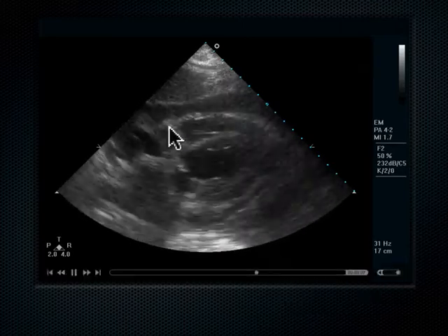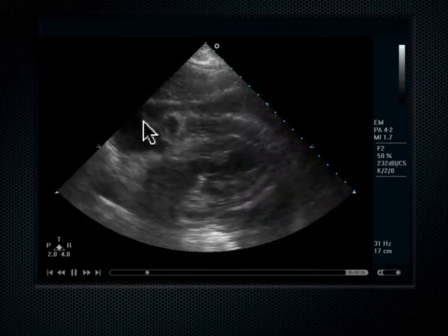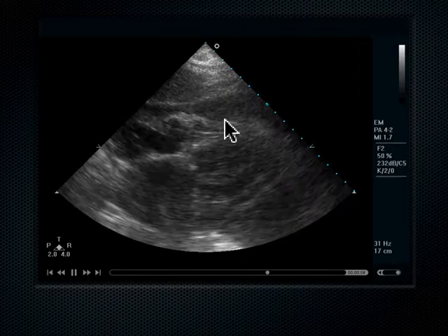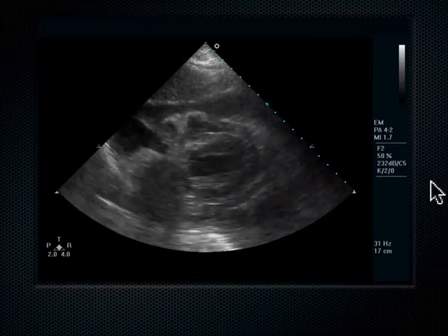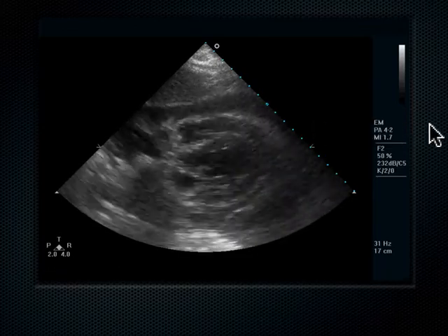Well, on ultrasound, you can see the guide wires coming into the RV. This is a subxiphoid view, because that's the liver. Not only can you guide the guide wire, but you can also see when the electrical activity becomes mechanical capture. And so you can see all of a sudden when you get in the right spot and you start to see the heart become mechanically captured. I wish I had the earlier part of this clip where the guide wire was coming in and then all of a sudden it started to capture, but nobody recorded that part of it.